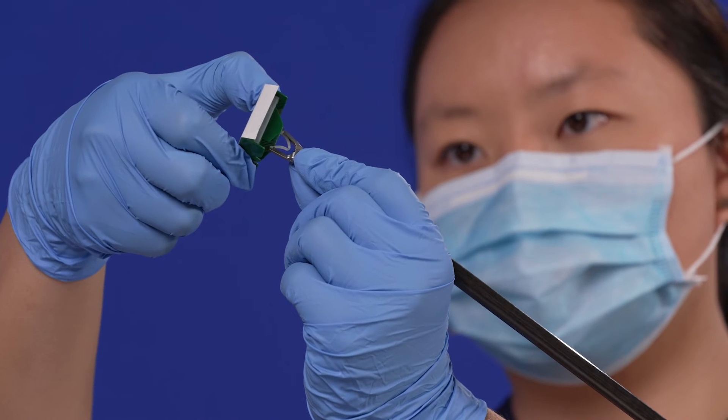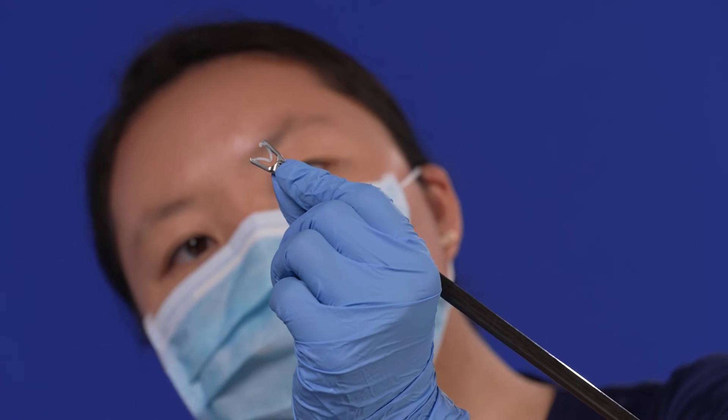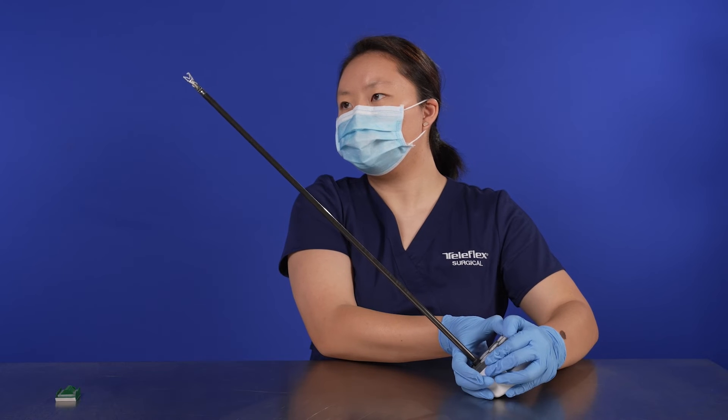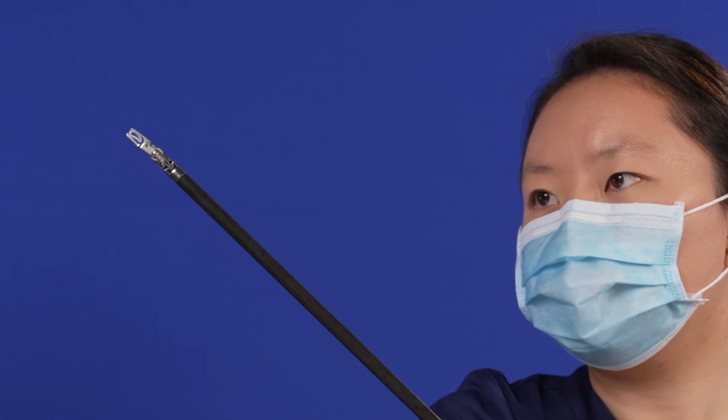The applier should enter and withdraw from the cartridge easily. Once installed, visually inspect the instrument tips to ensure that the clip is securely seated in the applier jaws. The clip bosses should be seated in the notches of the applier jaws.